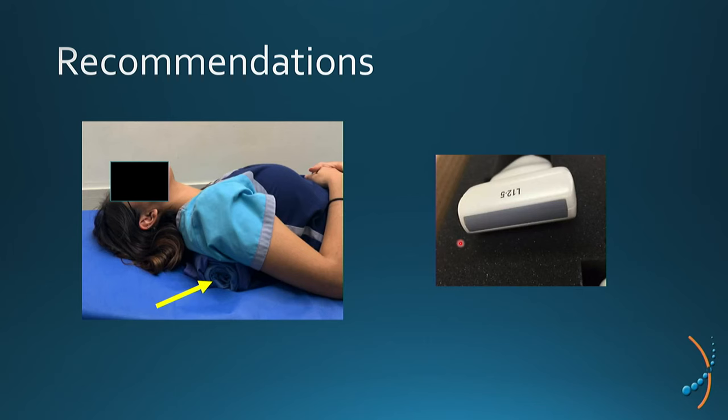As parathyroid ultrasound is usually performed as a preoperative localization technique, and surgeons often find static ultrasound images difficult to understand, meticulous reporting with reference to constant anatomical structures is very important for the surgeon to perform the surgery.